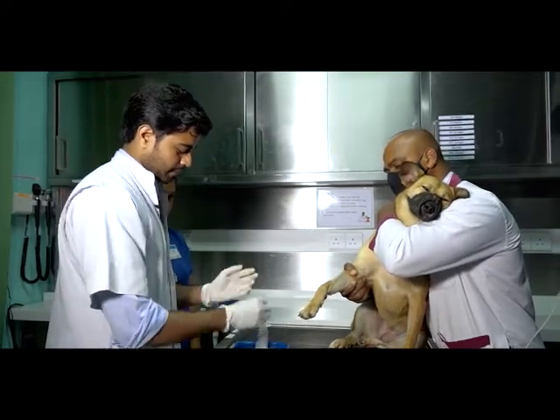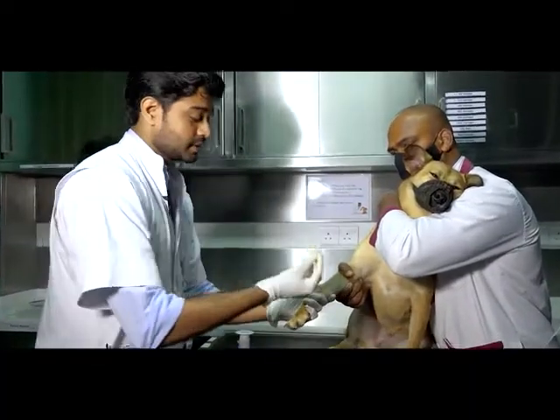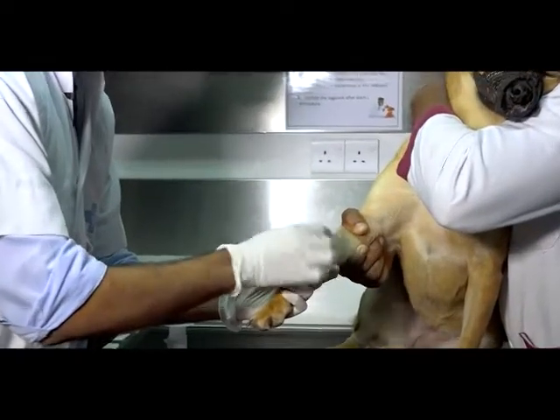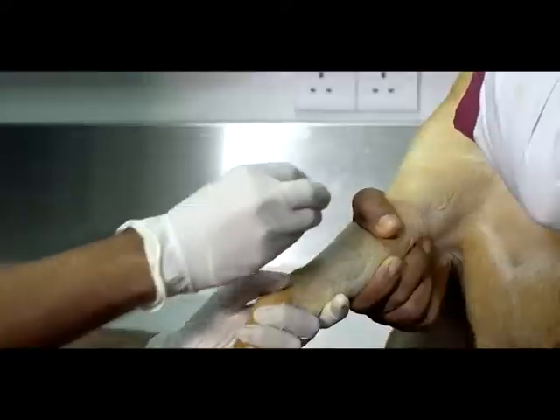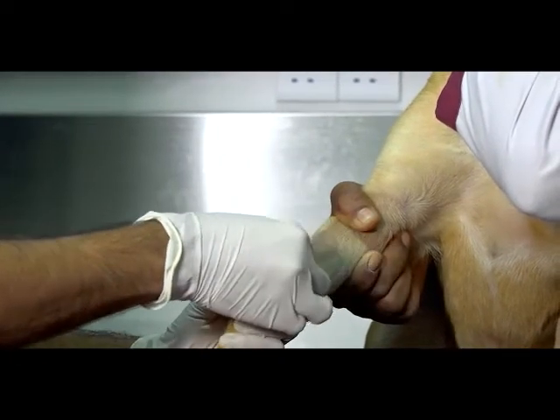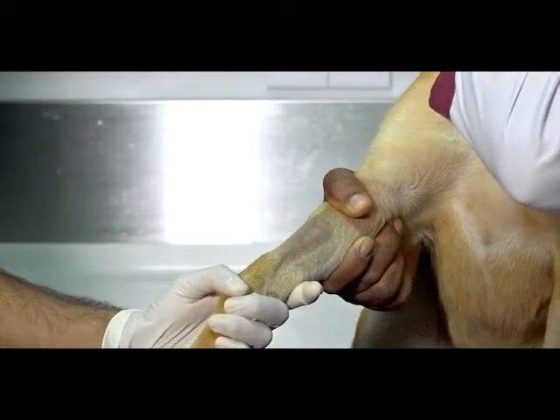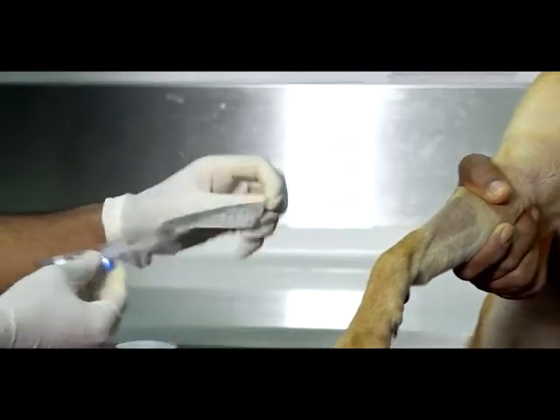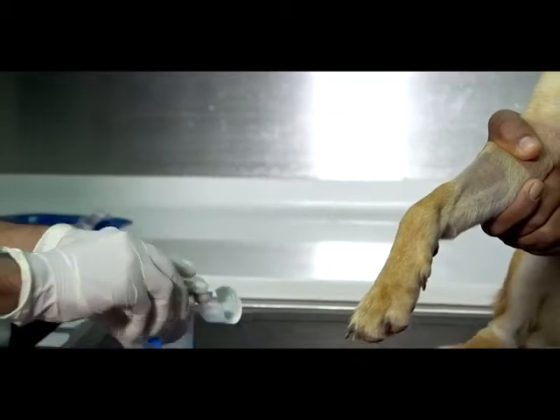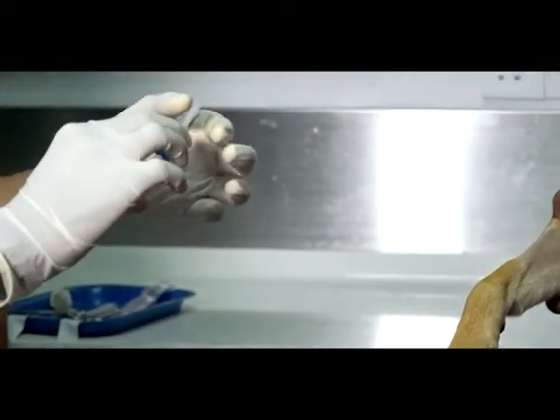First we will have to surgically disinfect the site. If it's quite dirty, we could just rub it off with surgical spirit. You would first scrub once like this, and on either side you would just scrub like this, just that. Then you're going to take the cannula, remove the covering.